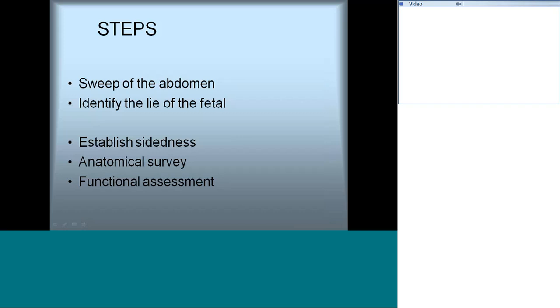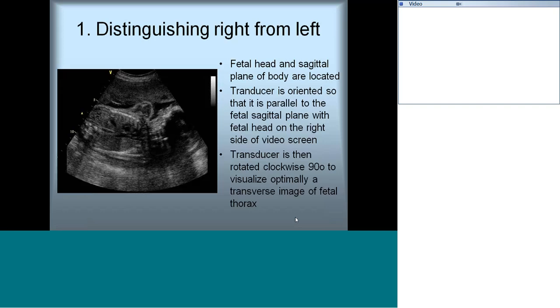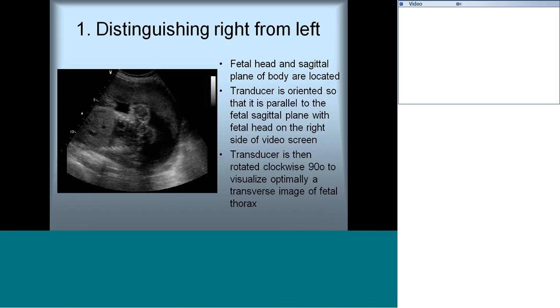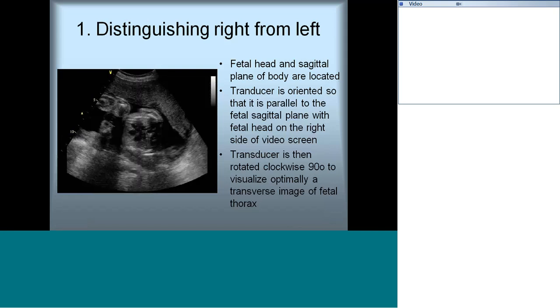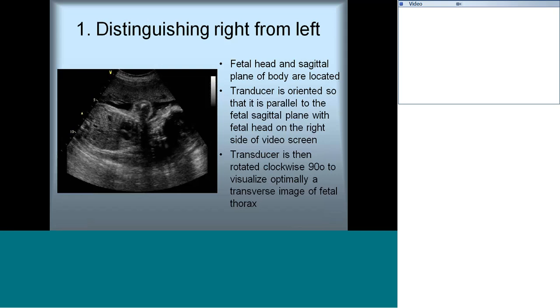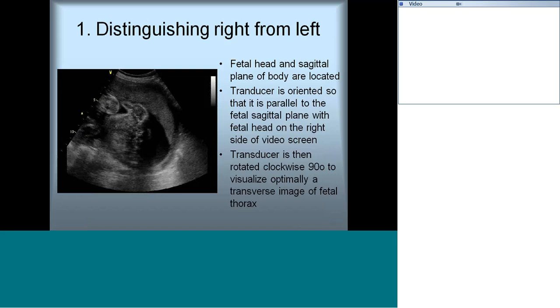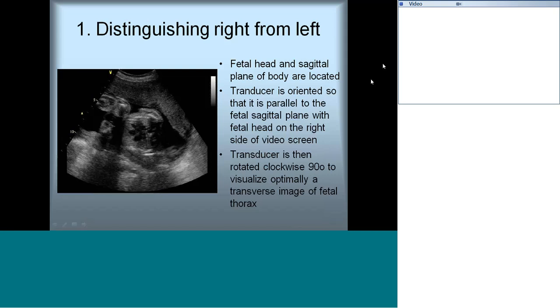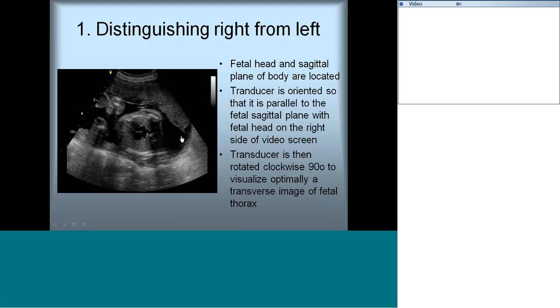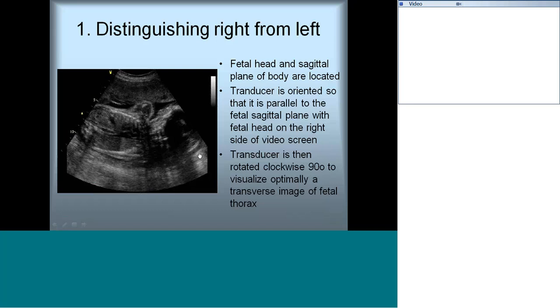The first thing we need to know is what is right and what is left for the baby. This is a very important and slightly difficult step. First, see where the baby's head lies and where the sagittal plane of the body is located. Try to put the transducer parallel to the fetal sagittal plane with the fetal head on the right side of the screen, as shown in this figure.